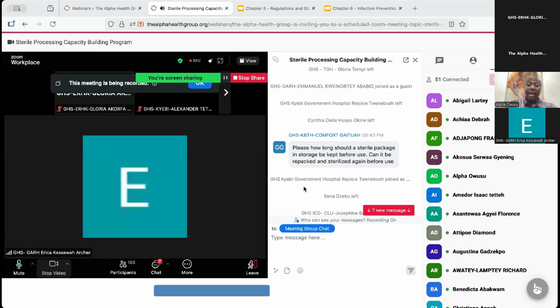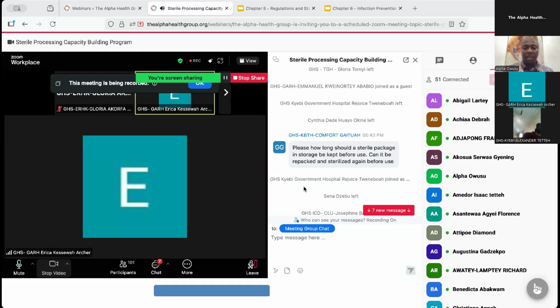And then when I come around, we will do some exercise where, if you don't have the detergent, the enzymatic spray, we have to come up with something so that we will still be doing the best practices. We will soak a towel. After cleaning the surfaces, we will moisten a towel. We are not going to use saline water, please, not saline water.